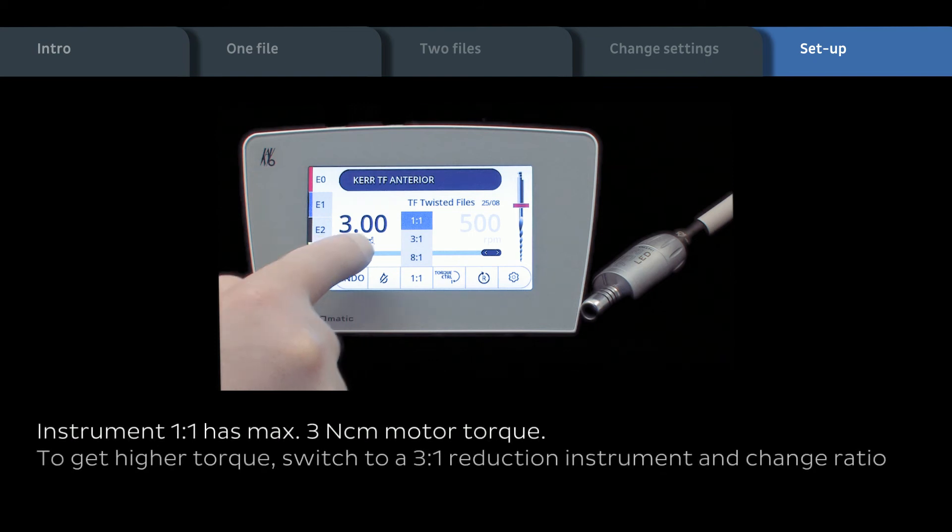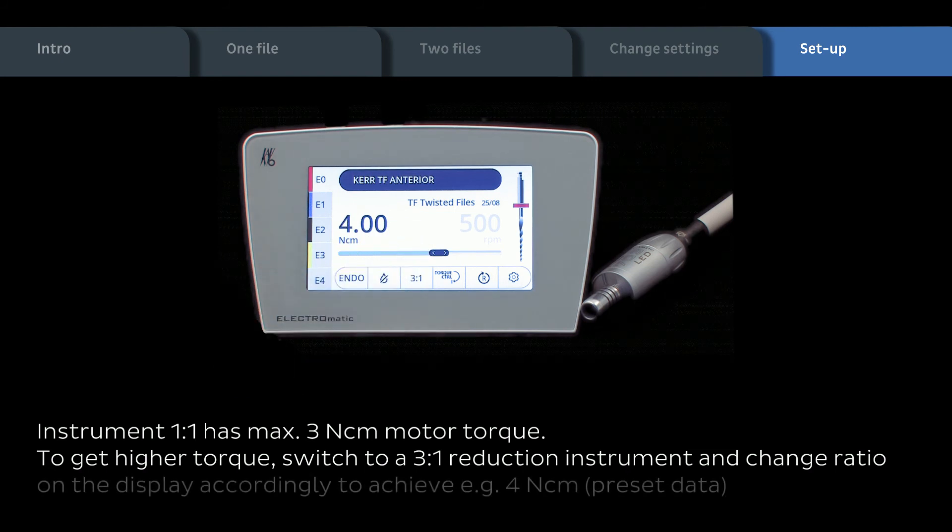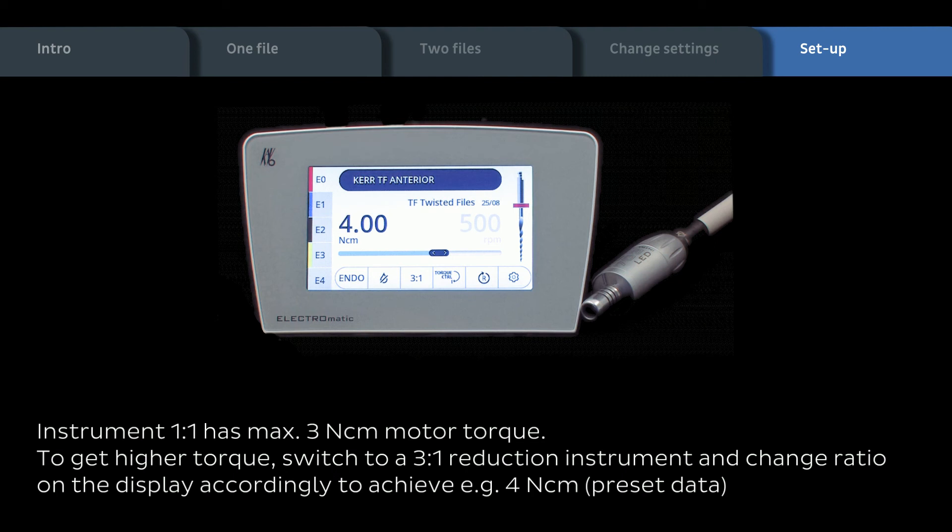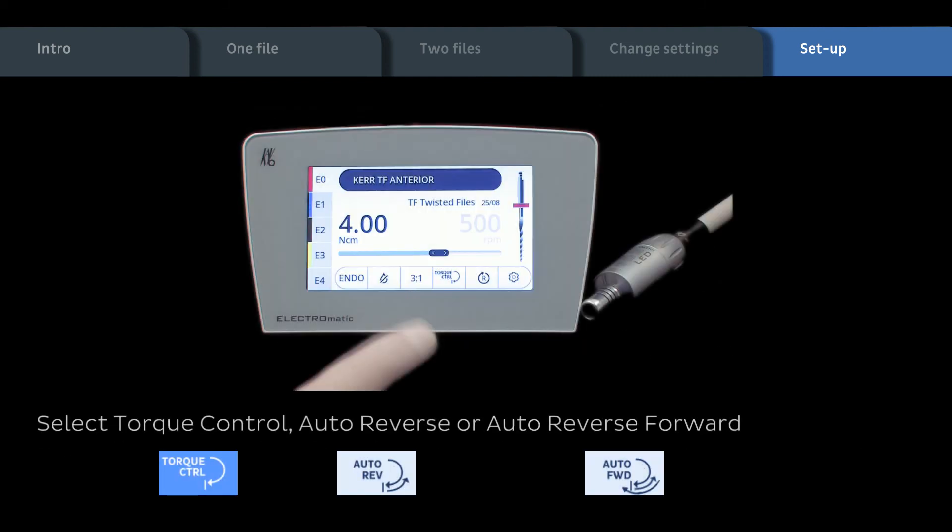To get higher torque, change to 3 to 1 instrument and get e.g. 4 Ncm. Preset value of database. Select maximum torque control possibilities.